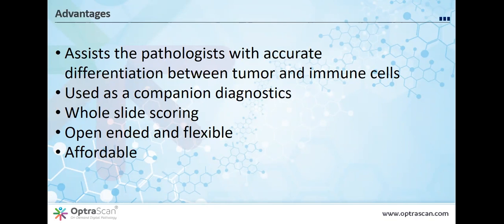And if we take those two sets of slides out of the slide tray that we're being asked to look at as pathologists on any individual day, it removes a number of cases from our workload. We can then go look quickly at the slide, say, oh yes, the algorithm got it right, I can sign it out. And we can then focus our time and effort on the cases where the score is closer to whatever the threshold is for the test you're doing, 1%, 5%, or whatever. And that's where we need to spend the time.